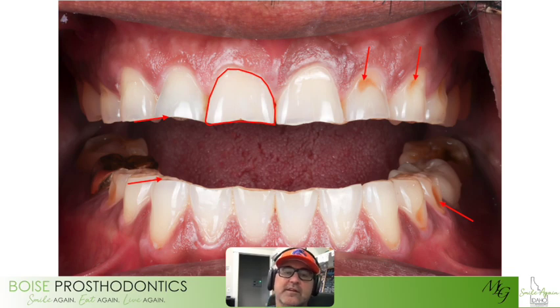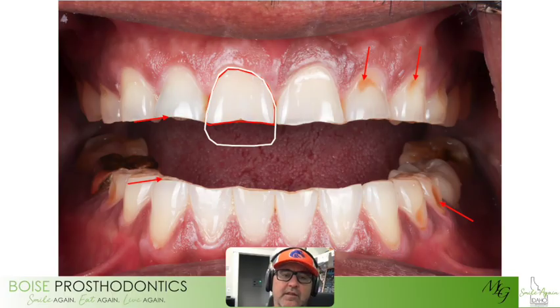Now, with this data, I love doing an analysis of getting teeth the right size and shape. So here I usually outline what the tooth form looks like now, and then overlay that with what a normal, quote-unquote, tooth size and dimension should be, so the patient can see it. And you'll see we're probably missing easily 2 to 3 millimeters of tooth length if we're trying to obtain the ideal height to width ratios, which most teeth present with.